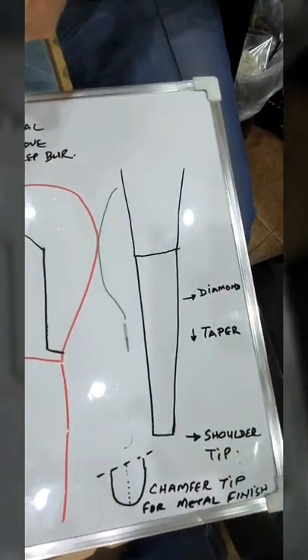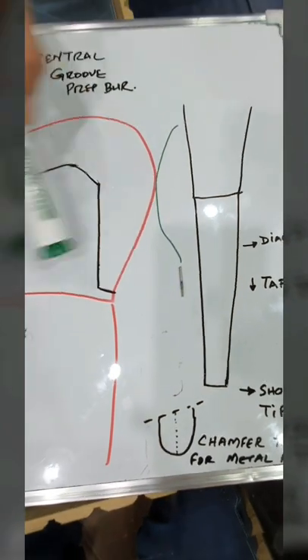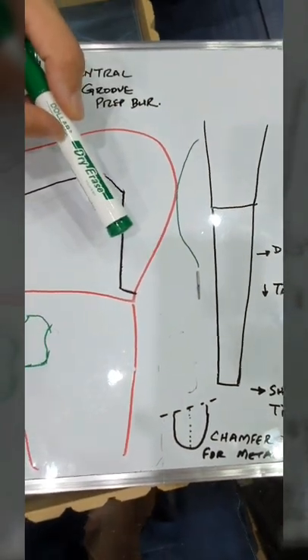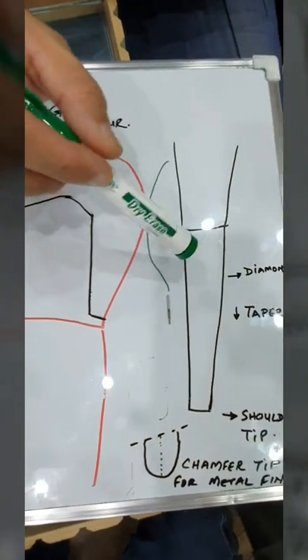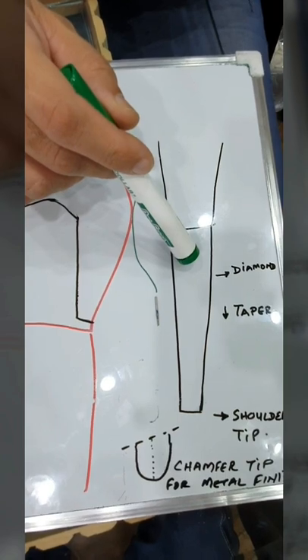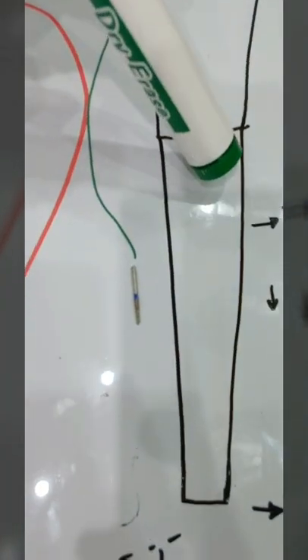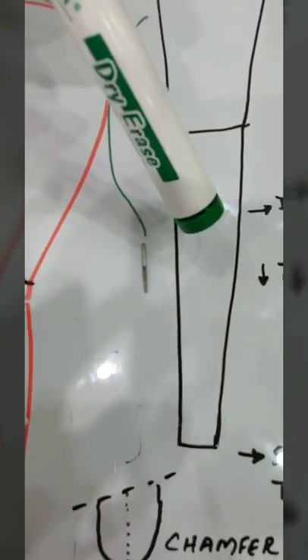So if you were to hold the burr parallel to the long axis of the tooth all around, you should be able to get that taper built in your prep because of the burr being straight and with the built-in taper. So I suggest do not buy a burr which is 100% straight, a perfect straight cylinder. Do not buy that. Always buy a tapering burr and diamond coat it.